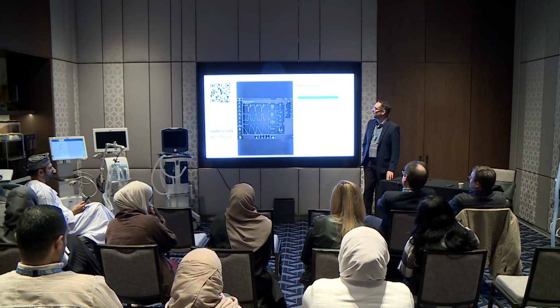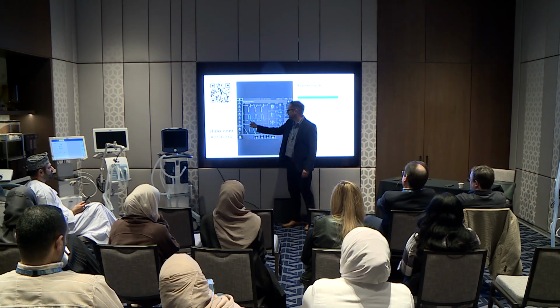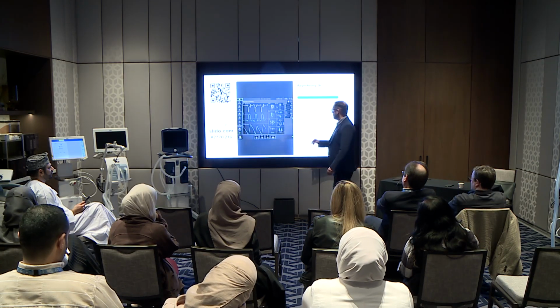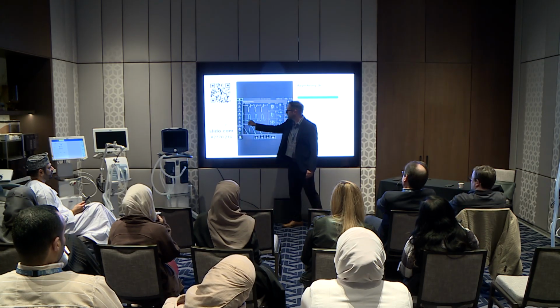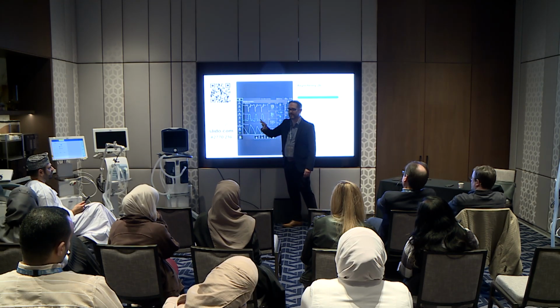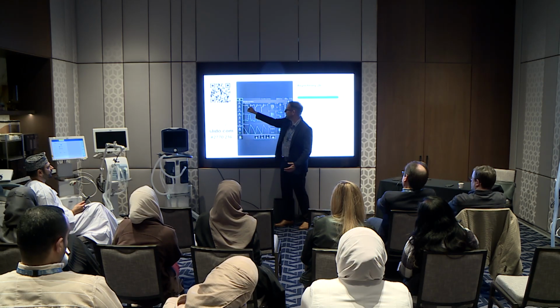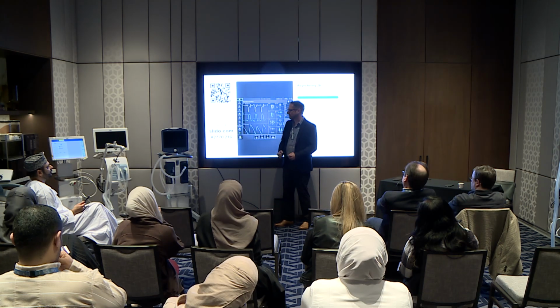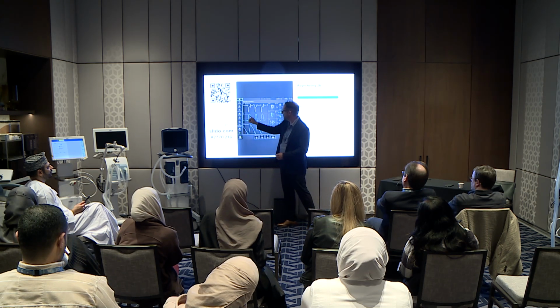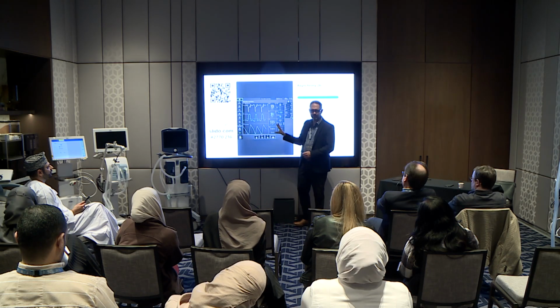Okay. But the question really, like, what's the biggest problem here? So, is there blunting of the expiratory flow? There could be. Breath stacking, this is one breath. This can be hard to interpret because it's completely opposite, right? This is supposed to go up during inspiration. And instead it's going down because the effort is so strong. So this, breath stacking, this can be confusing, but just look at the flow. There's one breath, exhalation, another breath, exhalation, so it's not breath stacking.